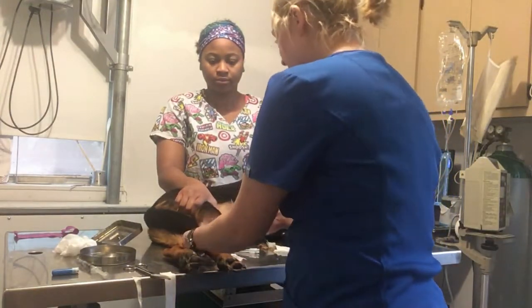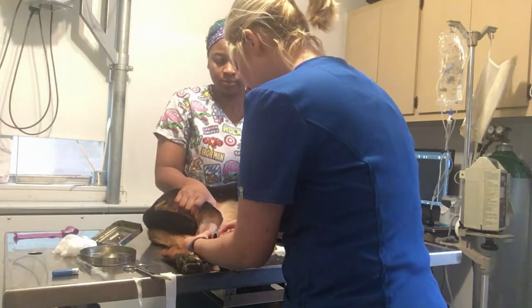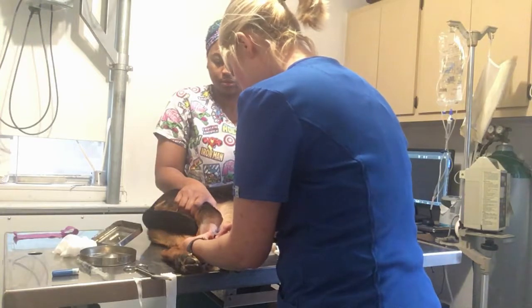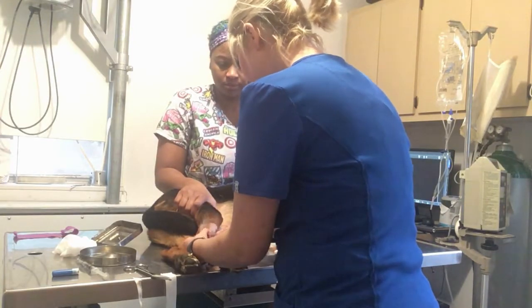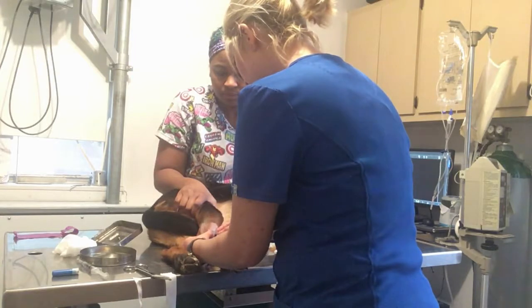I'm going to take it bevel side up and gently insert it into the vein. Once you get a flash, you can slowly thread the catheter through the vein.